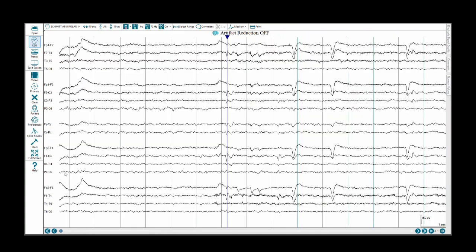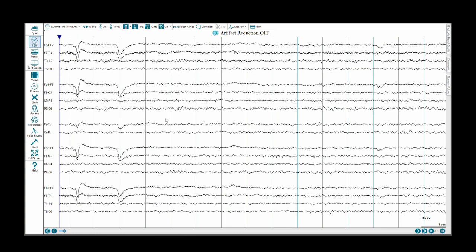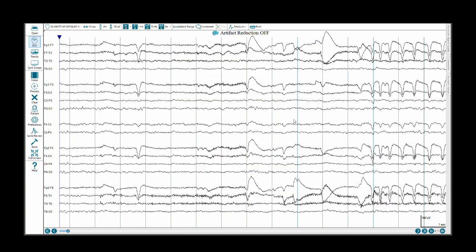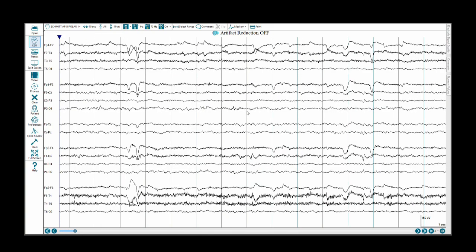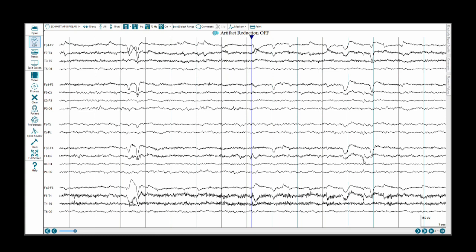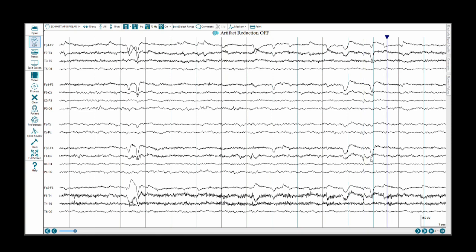Going back to the bipolar anterior to posterior montage, now we are just going to scroll through the EEG, and we are going to do a read of the EEG, while also keeping an eye out for these spikes and sharps. There is one right there, the dipole is not as apparent, and there is one there. If we work through the logic of the field distribution within a bipolar montage, we can explain it as follows.